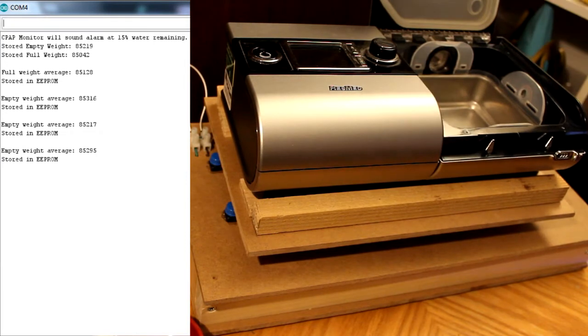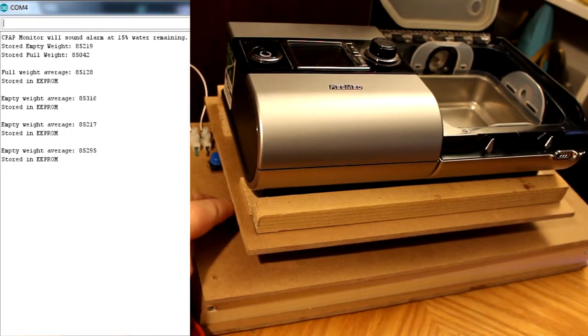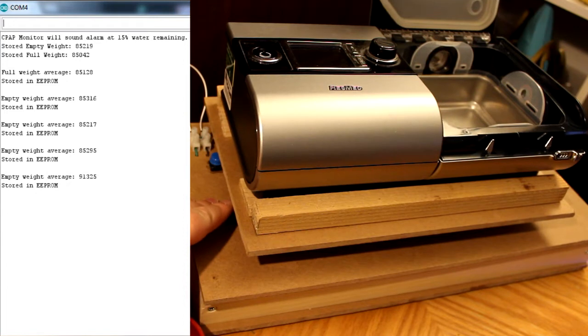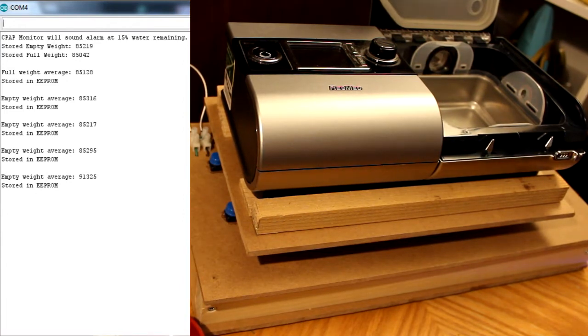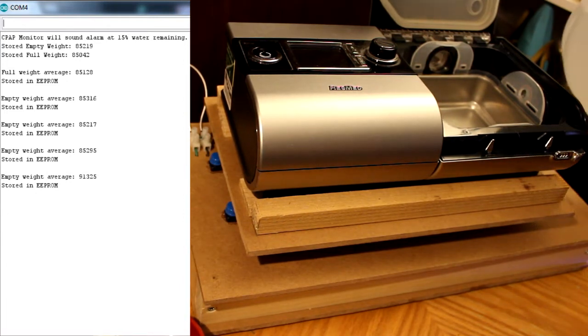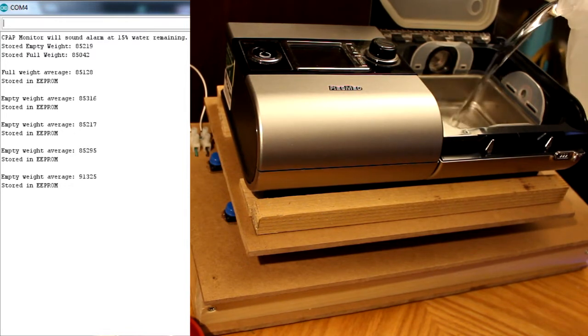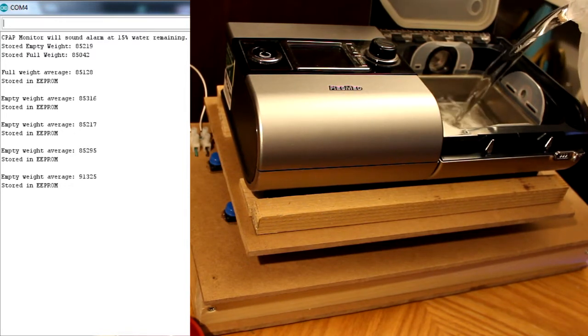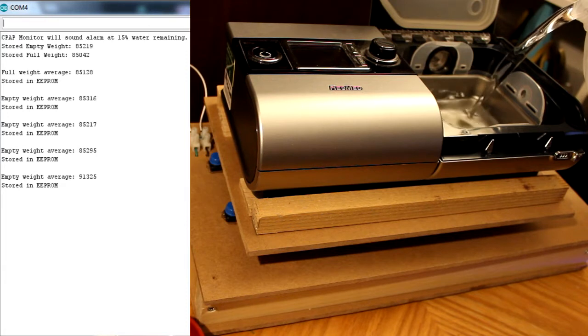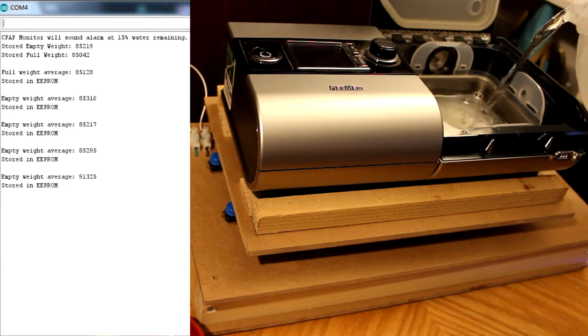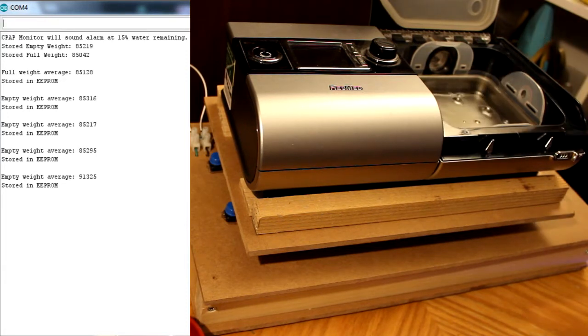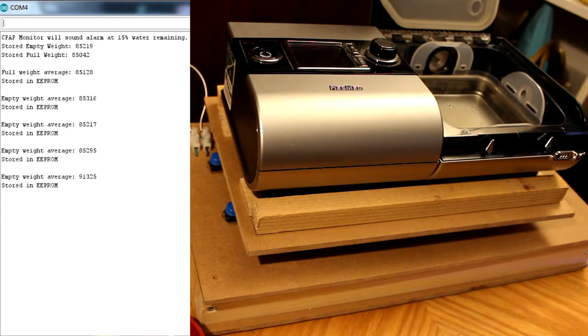If the empty weight set is larger than the full weight, an error sound is played. The device will not go into measurements as long as this is the case. A success sound is played if the full weight is more than the empty weight.